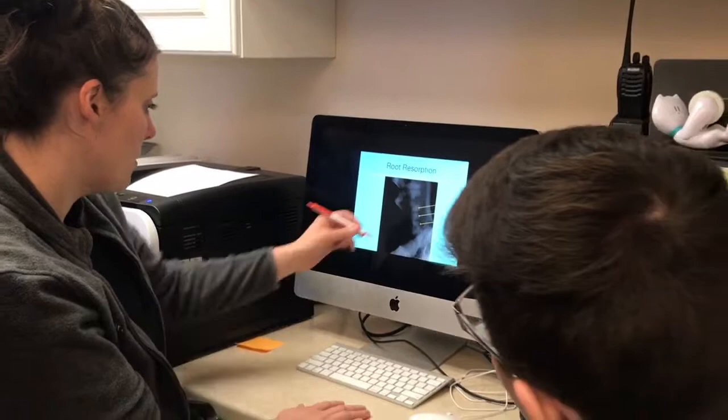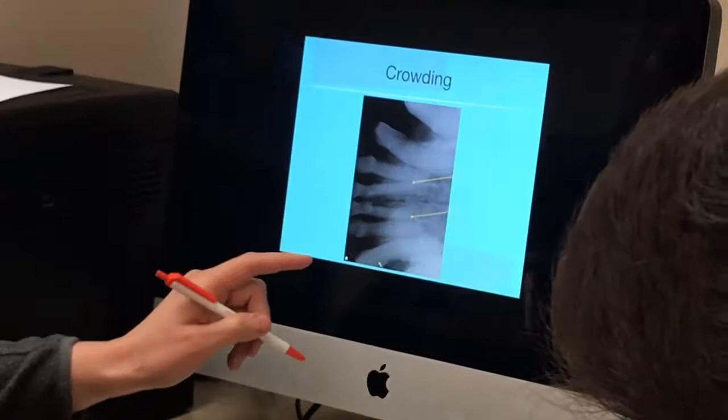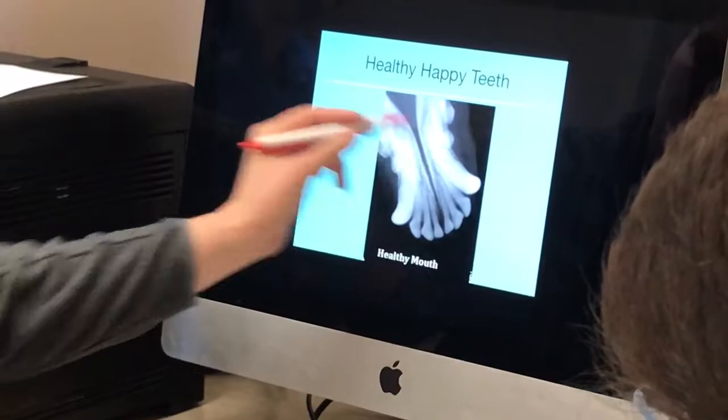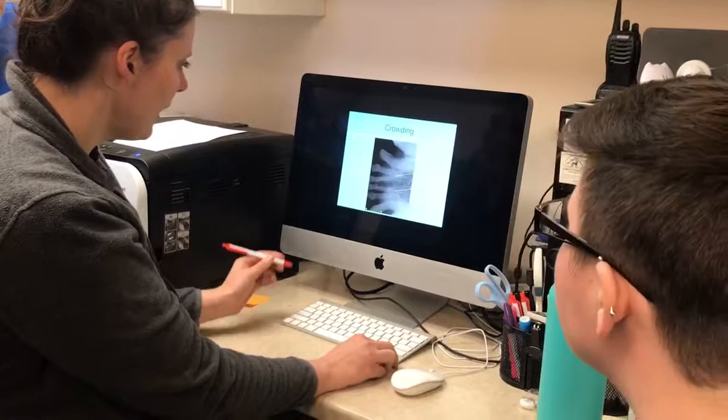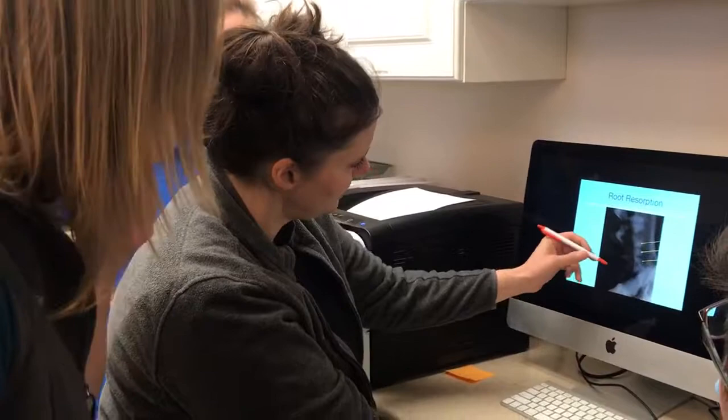This is a patient that had severe FORLs where the crowns of the teeth actually fell off and the roots are being resorbed. We know they're being resorbed because on the healthy X-ray there's a nice line around here — that's the periodontal ligament, where the tooth is held into the socket of the bone. In this one, there is no line anymore. The periodontal ligament is gone, so these roots are actually being resorbed back up into the body.